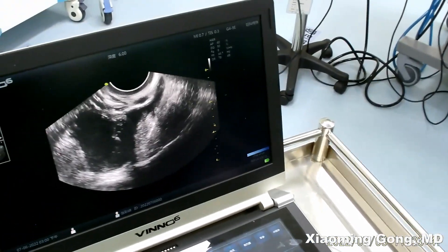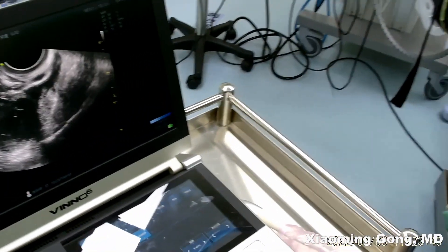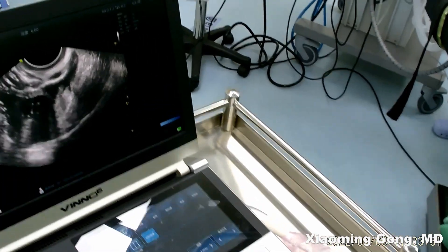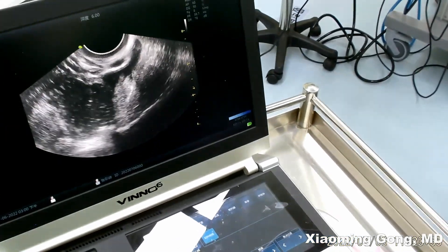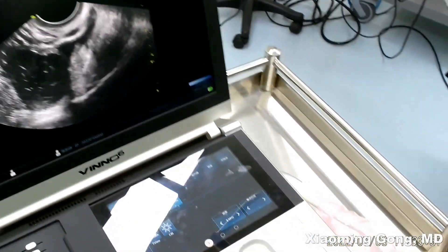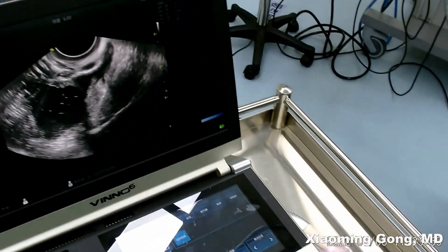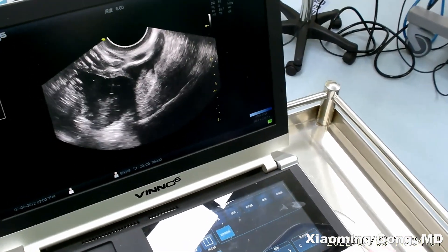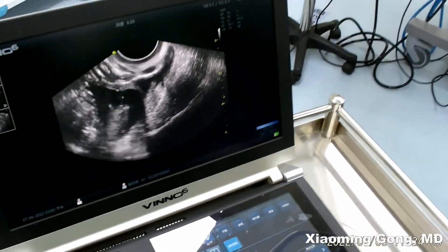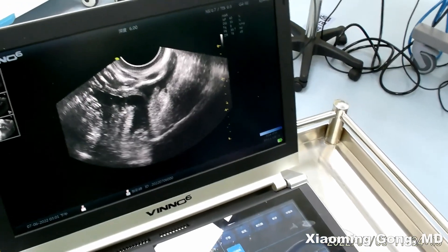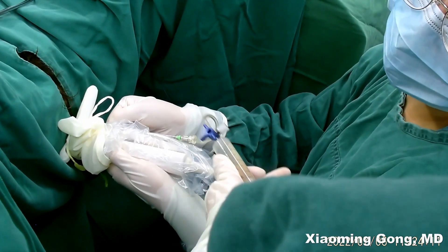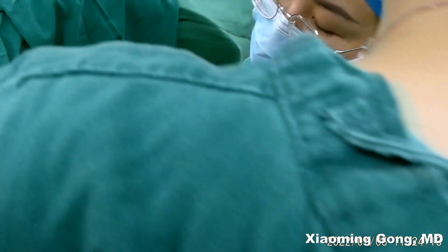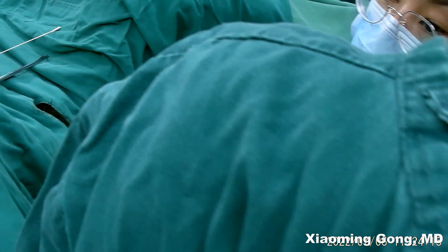If the cyst has multiple compartments, sometimes we have to perform sclerotherapy one by one, so it takes more time. But compared to laparoscopic surgery, the patient has much less pain and a faster recovery. It is still a very good procedure for our patients, especially for chocolate cysts.